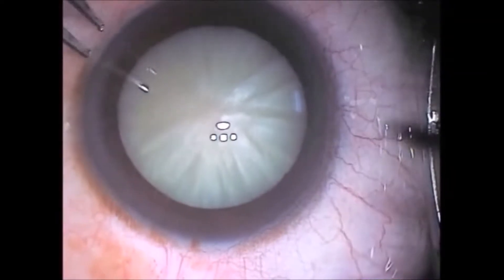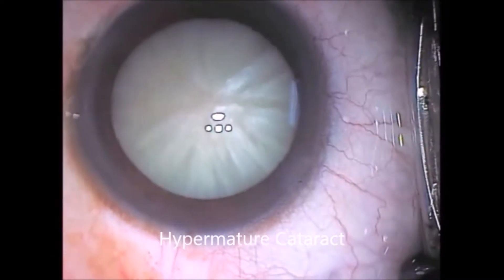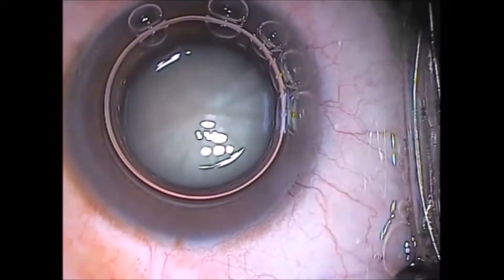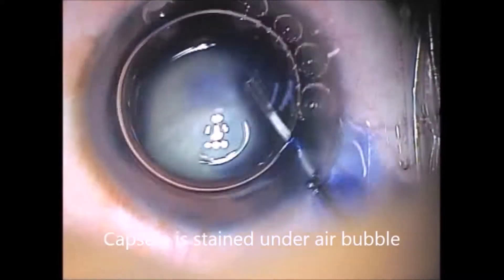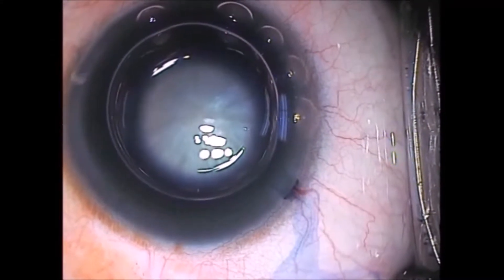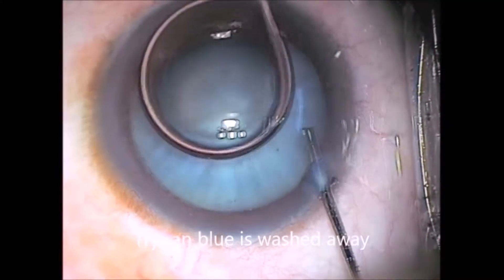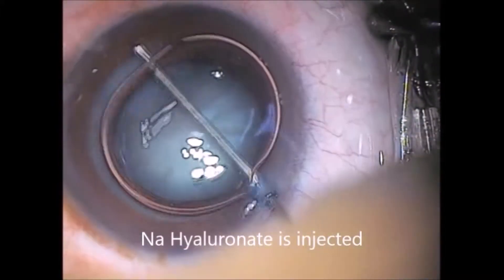This is a hypermature cataract. A side port is made with a 20 gauge MVR blade. The capsule is stained with Trypan Blue under an air bubble. Excess Trypan Blue is washed out. Sodium hyaluronate is then injected.